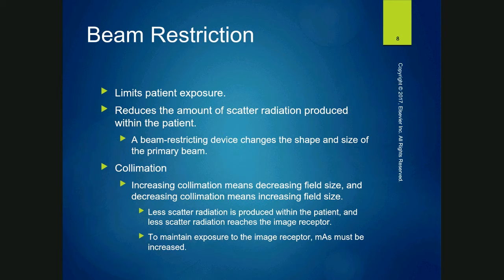Here's a review question. If they are lead, which they are, it's not made up, and they are stopping X-ray photons from exiting the tube, what interaction in matter do you think is happening there? Think about it. It's the photoelectric effect. It's complete absorption of the X-ray photons. So if they're absorbed, they're not getting out. There's not as much exposure to the IR.